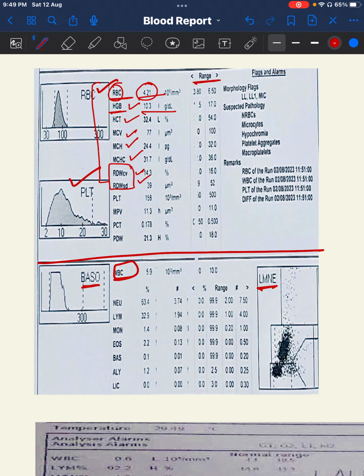Then how his or her blood is doing, or how many counts are there? So how is it responding? If they're taking any therapy for the anemia, then is it responding or not? So I need to have that. Definitely the hematocrit. We all know hematocrit is 3 times the hemoglobin. So I need to check that. MCV, MCH, and MCHC are the calculated parameters, and yes, they are very important in deciding the type of anemia.